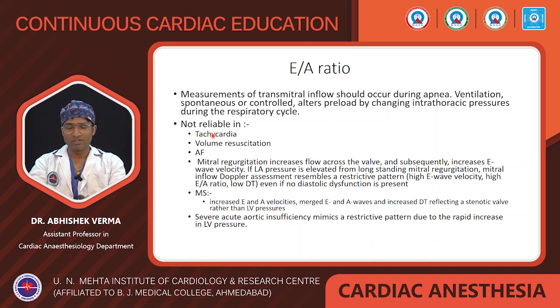It is not reliable in tachycardia, or if we increase the preload by giving volume, and also in AF, because there is no A wave. It is only diagnosed in sinus rhythm.